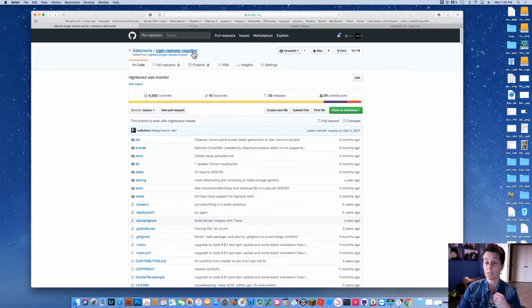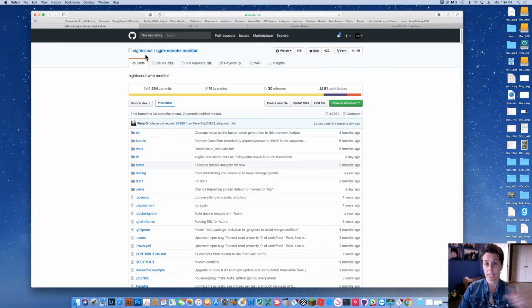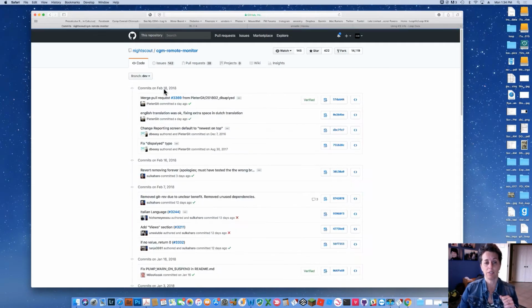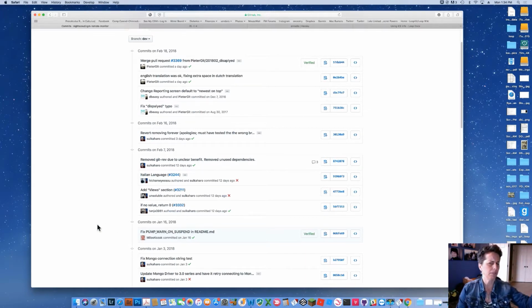When you fork it, you get the version as it was current back then. So often what happens with nightscout is our home copy gets outdated fairly quickly. Those guys are into developing pretty rapidly. And so you can actually see, if you wanted to, how often they develop. You can look at the dev branch over on nightscout's version at the public library, and you can see the commit history. And if you look on it, February 18th, February 16th, February 7th, January 16th, January 3rd. So something's happening at that library copy on their dev branch pretty frequently.